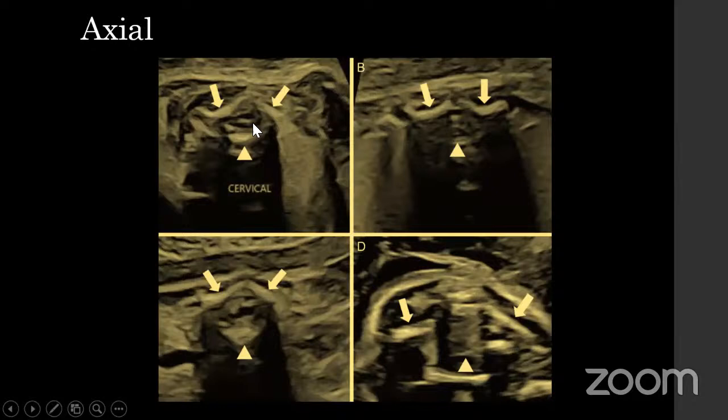Now, again, the axial section. The axial section is basically to see another important view, to look for the skin covering the spine. You are appreciating the lateral masses. Most importantly, you are seeing the spinal cord in the cervical, the thoracic as well as the lumbar section. But when you go down to the sacral section, you are seeing the iliac blades, the sacrum, but you're not seeing the cord. So when you're looking at the axial section, which should be done in all cases, you look for continuity of the skin, you look for the cord.